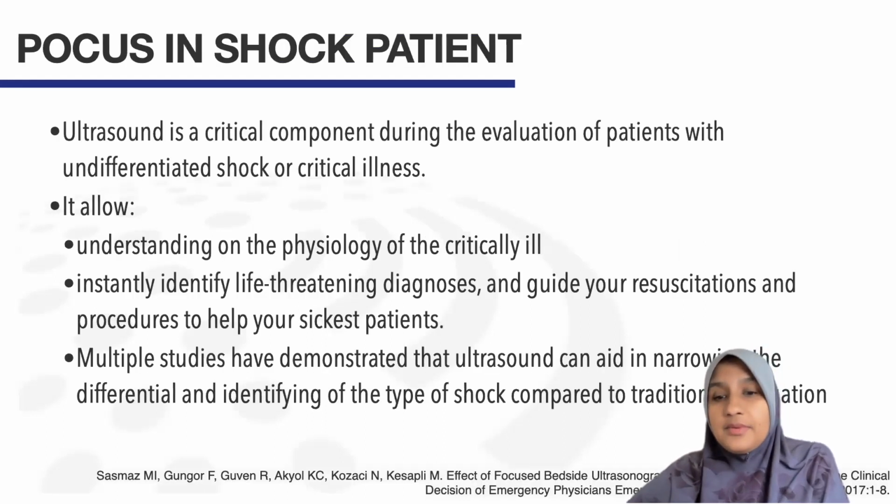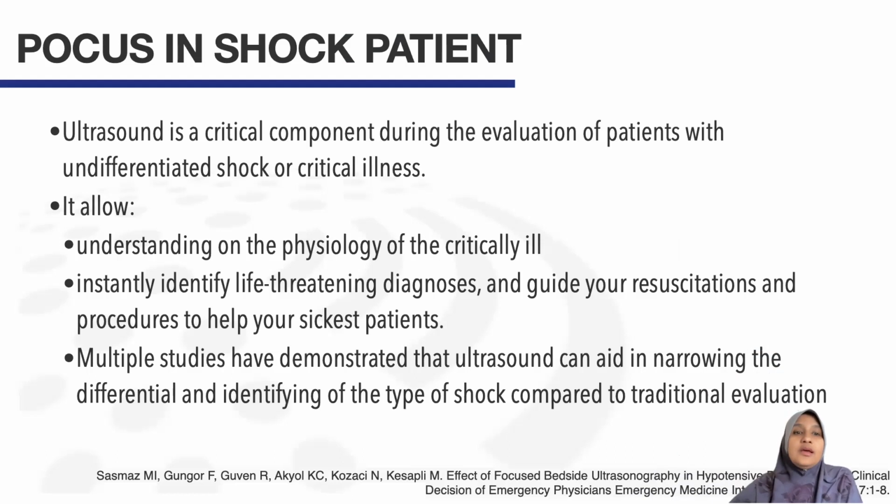So I think all of us have been using ultrasound quite frequently in our management of patients, and we know that ultrasound is one of the critical components during the evaluation of patients with undifferentiated shock, as well as in critically ill patients. It allows understanding of the physiology of the critically ill patient. It helps us to identify life-threatening diagnoses and guide our resuscitation and procedures to help our sickest patients. For example, in a patient with cardiac tamponade.